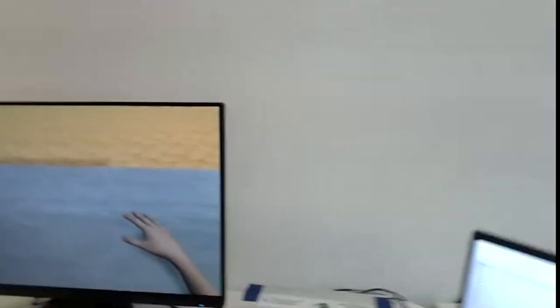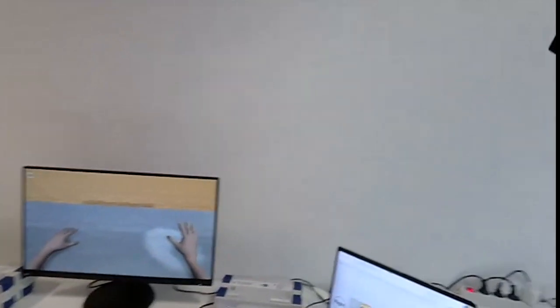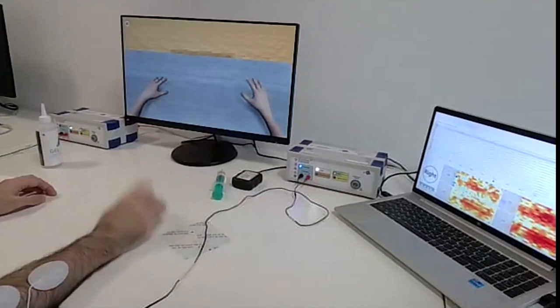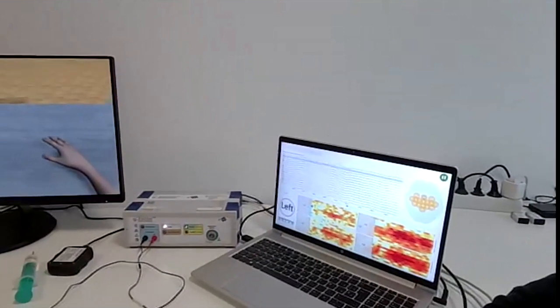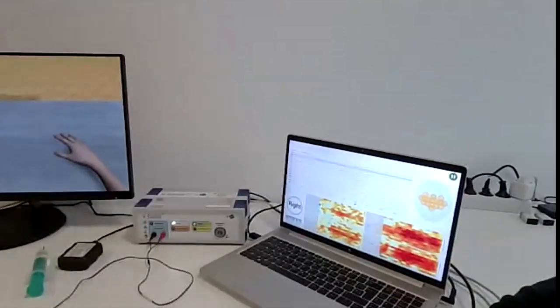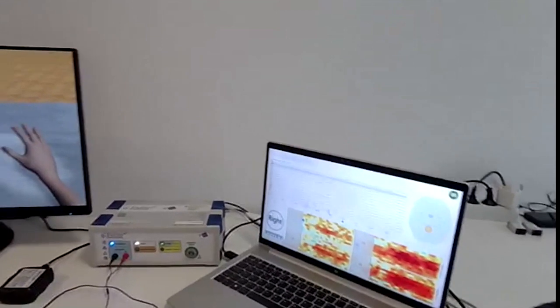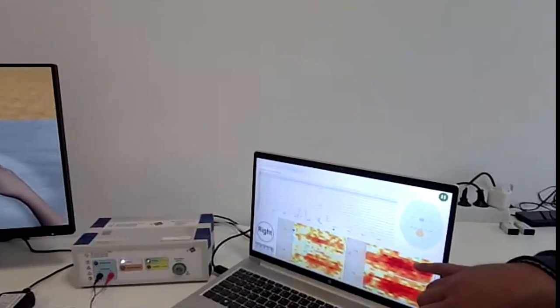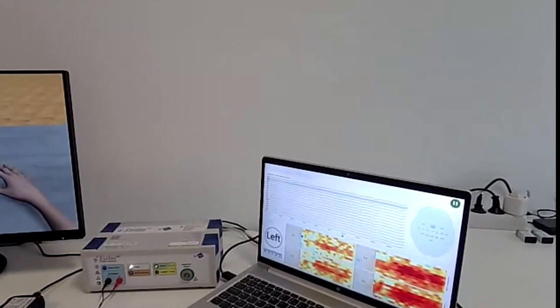So we always see this positive feedback going on because we are in calibration mode. We are calibrating the system. But more or less we are disturbing him a lot because we are talking next to him. He tries to be concentrated, but I think that it's a hard task for him now. And I'm also moving around him, so I'm creating some artifacts because I'm touching his head sometimes. And you can see these artifacts on the signal.